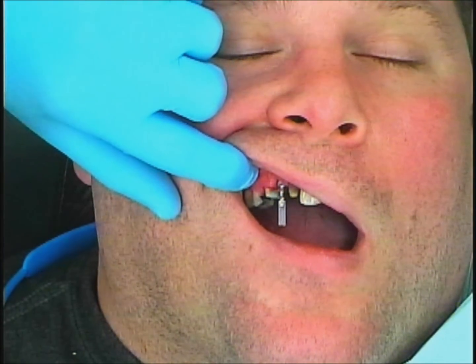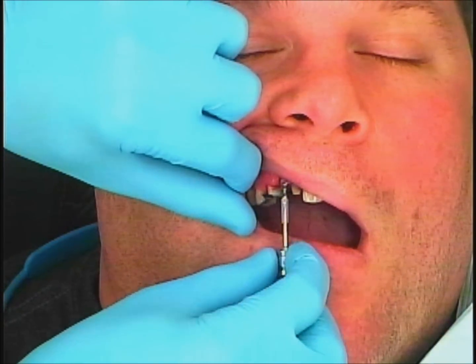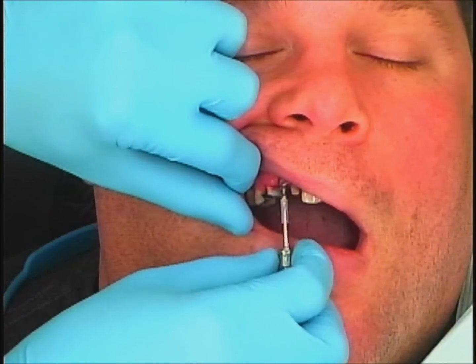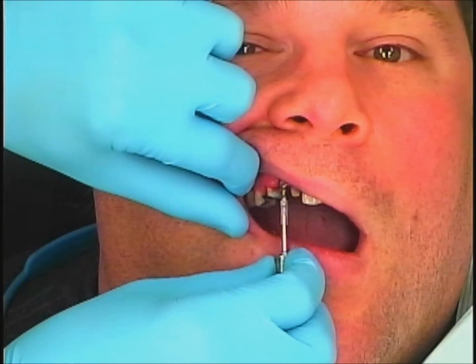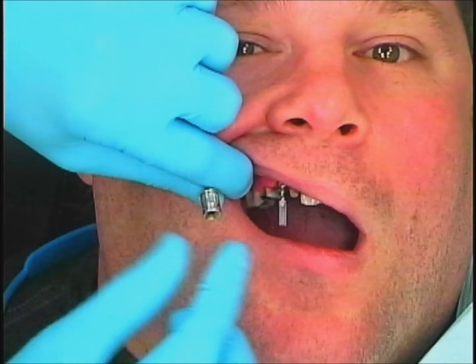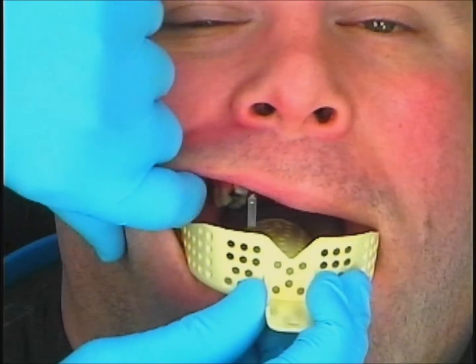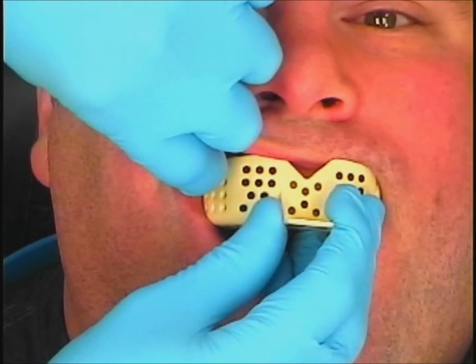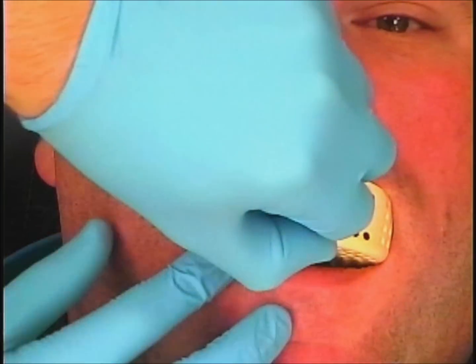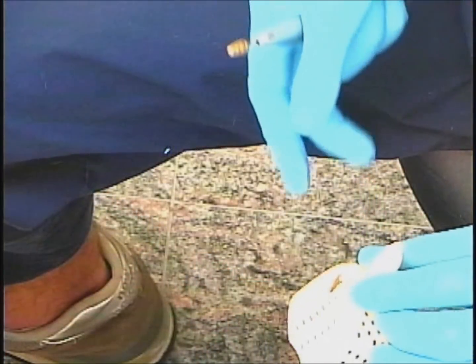That means I don't have to take a bitewing radiograph to confirm that the system has been fully seated. So you see here I'm tightening that down, and then I'm going to be ready to go. I'll begin by taking a stock tray and just making sure that it fits — the right size tray for the arch of the patient — and I'm also looking to see roughly where that impression coping is in relation to the rest of the arch.